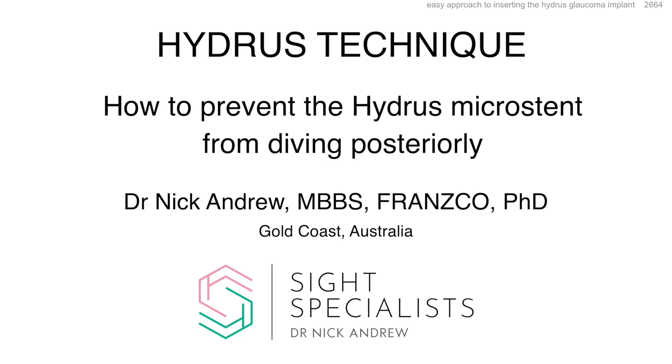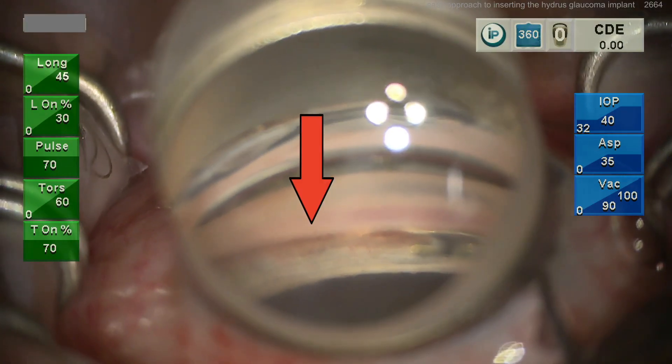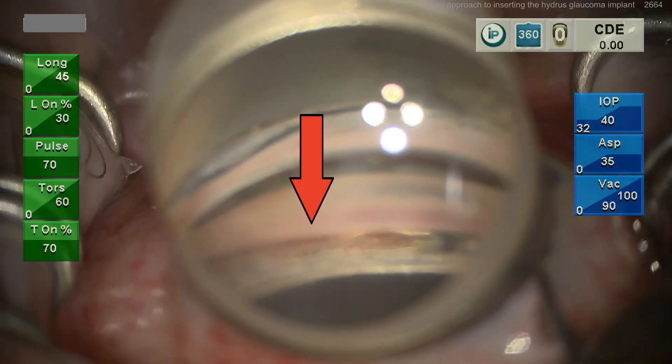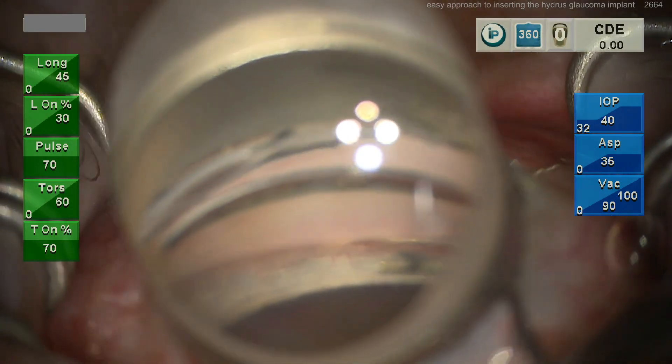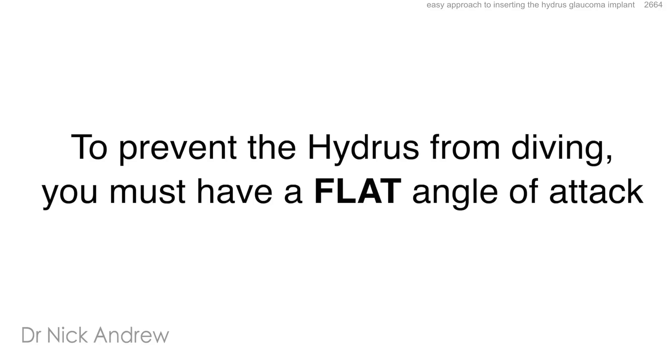This video describes the implantation technique for the Hydrus micro stent and explains how to prevent the stent from diving posteriorly. This is an example of what we don't want — the distal portion of the Hydrus stent exiting Schlem's canal and diving posteriorly towards the iris root. To prevent the Hydrus from diving, you must have a flat angle of attack.